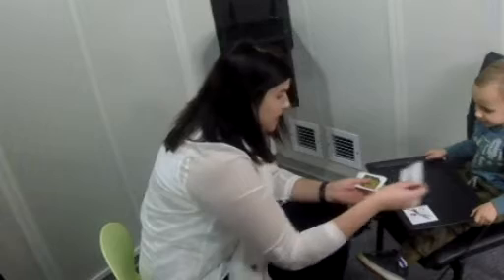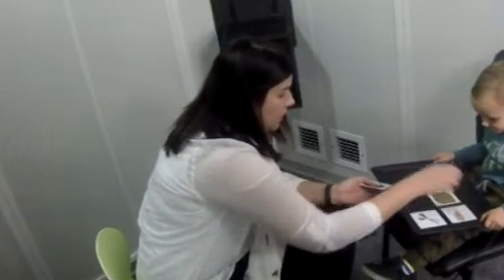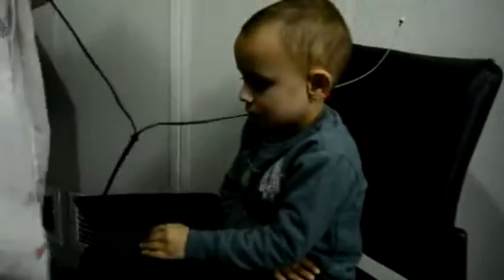The McCormick Toy Test is an English discrimination test that was also adapted for English additional language and Afrikaans speakers. These tests use minimally paired words which are generally recognized by children from an early age. Either picture cards or toys can be used as testing material. The testing procedure will now be demonstrated with the adapted Afrikaans McCormick Toy Test.